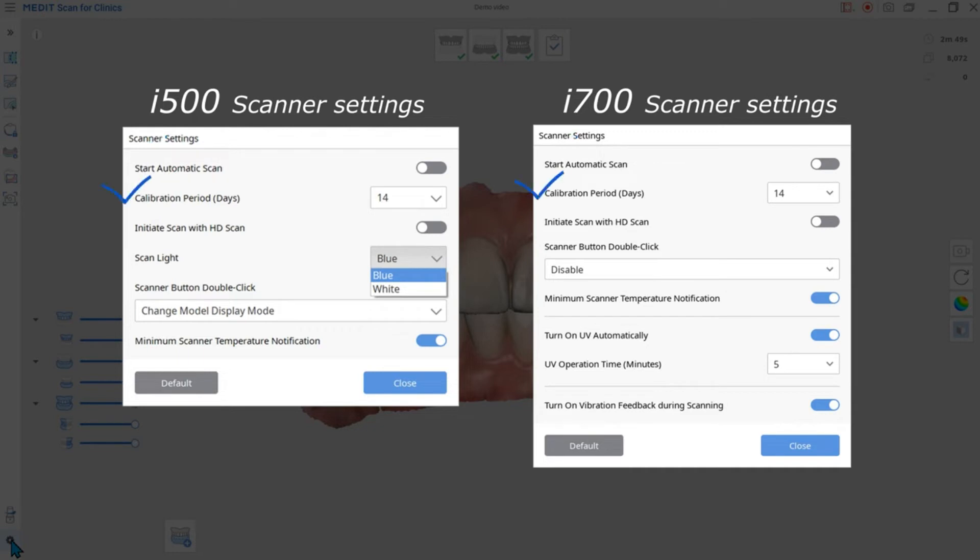Calibration period allows you to set the calibration period of the scanner and ranges from 1 to 30 days. The default calibration period is set to 14 days. Please keep in mind that calibration is required for data accuracy.